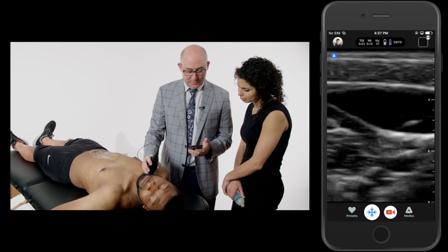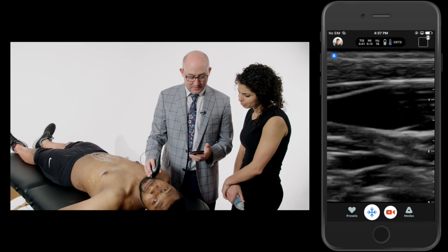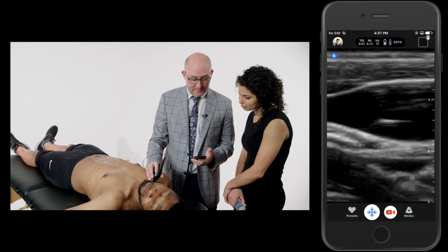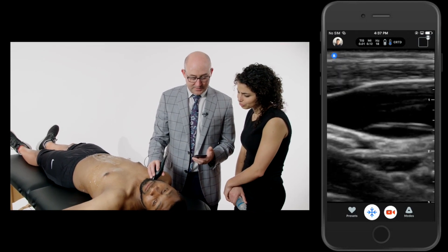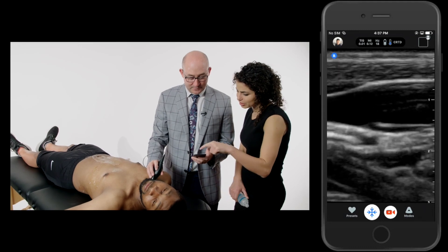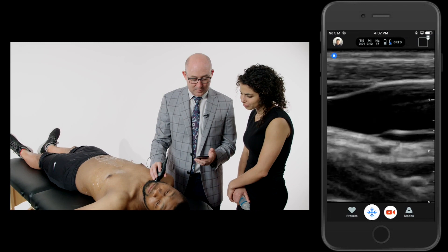From that valve in transverse, I'm going to go see how it looks longitudinally — something I'd be showing my medical students. You can see the valve leaflets now in the longitudinal plane as the sound gets more in-plane with the valve leaflet itself. You can see it come up and co-apt the other valve as he breathes in and out.